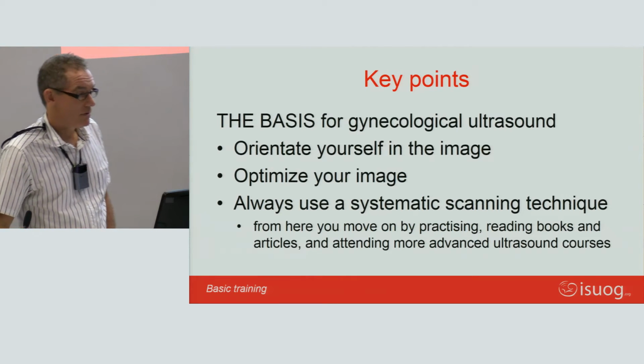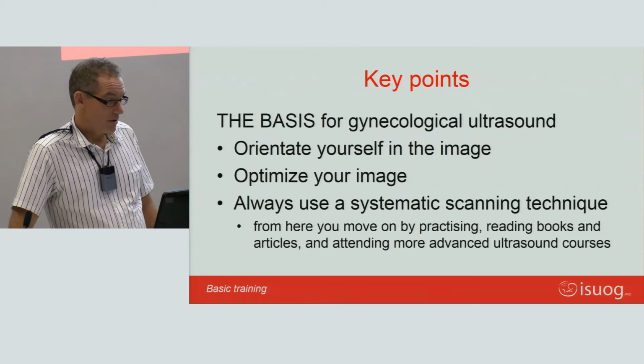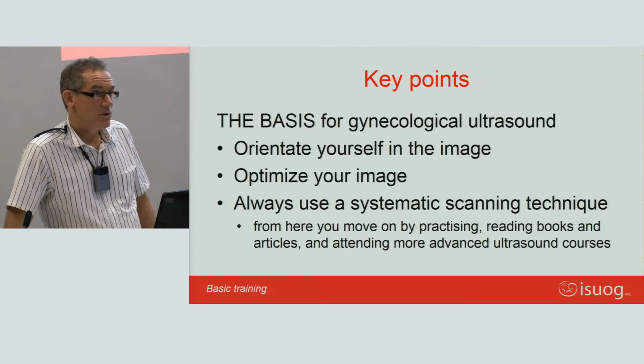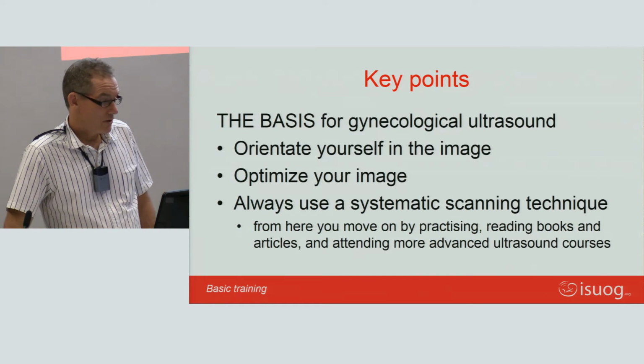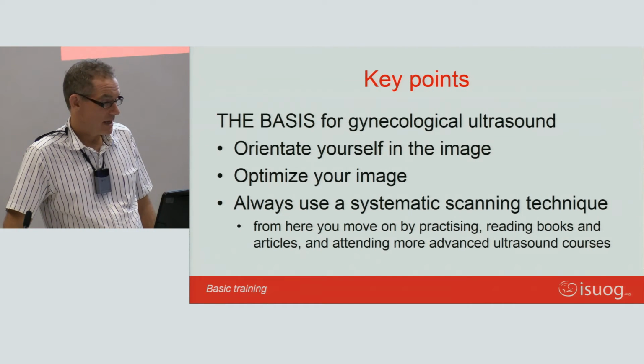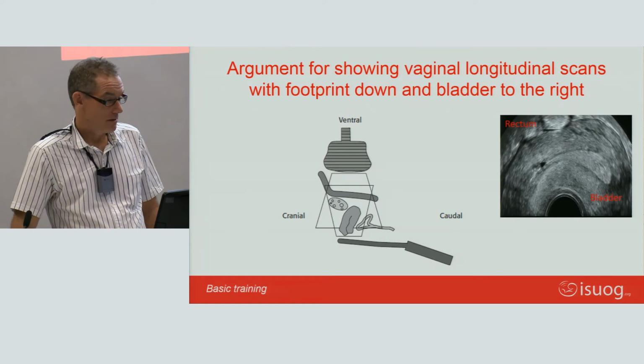Okay, so the basis for gynecological ultrasound, you need to orientate yourself in your image. And whatever way you've been taught to scan, you should probably continue with it, because that's the way you used to. Always use a systematic scanning technique, and just practice the same way, because in that way you'll become familiar with it and you won't miss things.